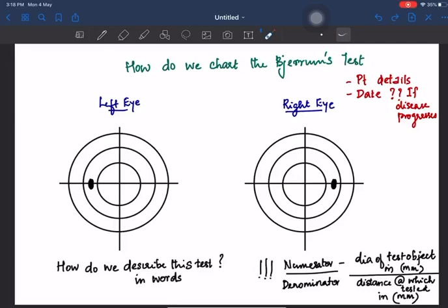So here I'll be telling: both eyes central 30 degree field of vision is normal with normal physiological blind spot when tested with 20 by 1000 mm white object. It is very important to state the color of the object as we mentioned earlier, because a colored object gives less stimulus than a white object of the same size.